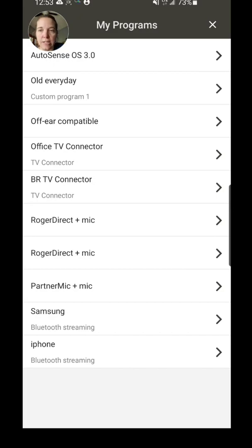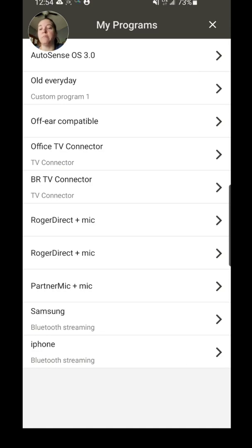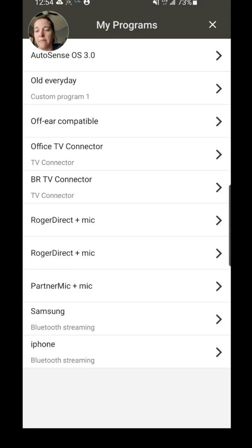Now each of these you can actually change the name of the program. So because I have two phones, if you look at the bottom there, you'll see Bluetooth Streaming and it says Samsung and it says iPhone. Those I created the name for; otherwise it just says Bluetooth Streaming.